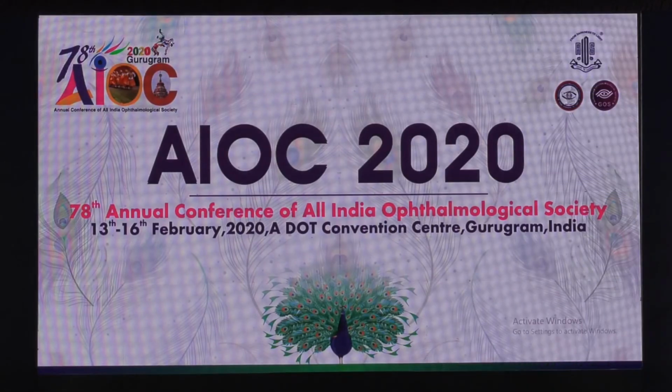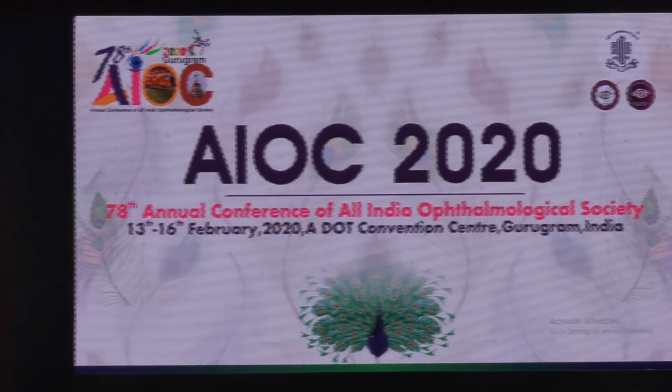My question to Dr. Reema: ma'am, these days are you doing just a purely vitreous biopsy using vitrectomy, or like earlier, we used to do vitreous biopsies with a 26 gauge needle in the OPD or emergencies? Is that indicated anymore? No, I think, Pooja, in the era of microincision vitreous surgery, just vitreous aspiration is not recommended. We don't do it. We simply go for a good vitrectomy that helps for both diagnostic and therapeutic purposes. Just aspirating, no, I think it has more complications.